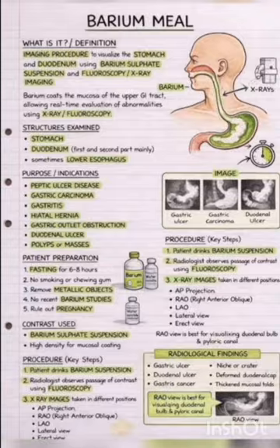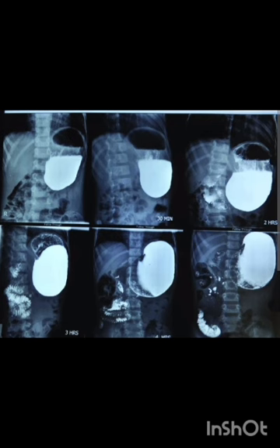For air-filled duodenal bulb, the patient is placed in left lateral position, gas fills the duodenal bulb and spot film is taken. For the air fill in the upper body of the stomach, the patient is placed supine with the table tilted head up. In this position, gas fills the upper body of the stomach and then spot film is taken.